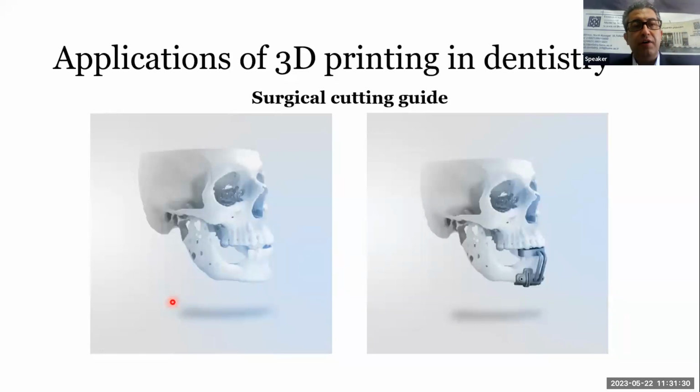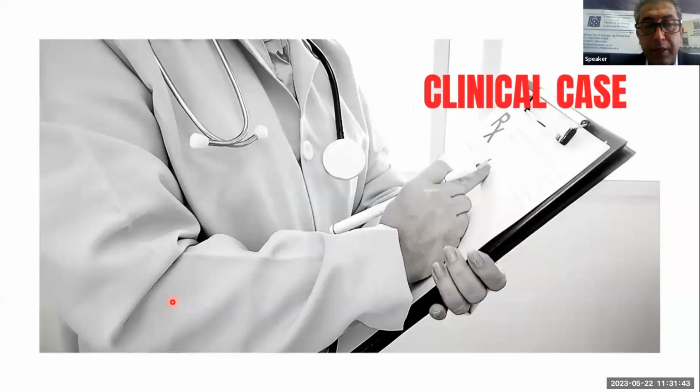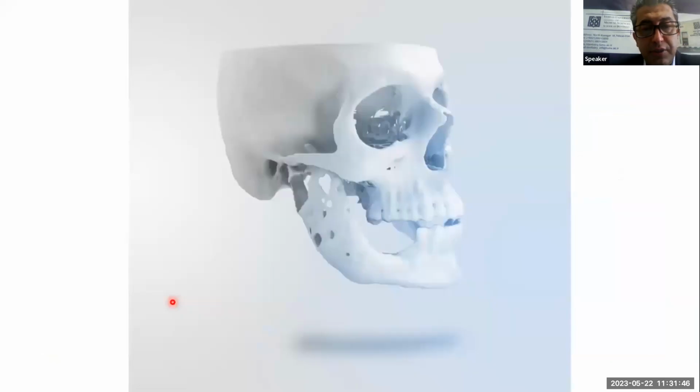Another application of 3D printers that is very interesting is making cutting guides. These cutting guides are very useful, especially in patients who had a pathologic lesion of the mandible. Let me show a clinical case here.